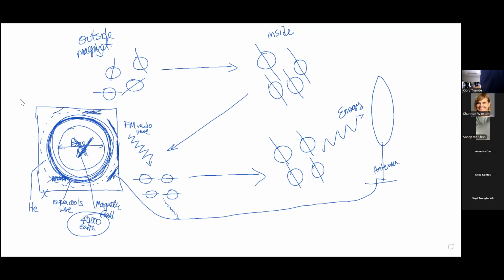But another place the antenna can be located, and where we use it for most of the imaging, is you wear this kind of light foam thing that sits on you, and that's got lots of little antennas inside it. We'll talk about lots of little antennas in talk number 3. So antennas then pick up the energy, and that's what's used through a process called a Fourier transform to make the picture.